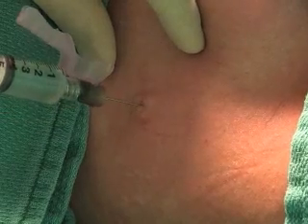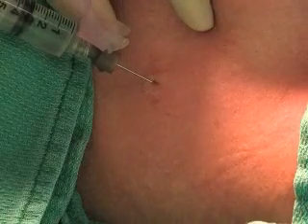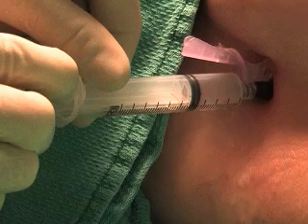Using the larger needle, anesthetize the subcutaneous skin layers through the wheel, aspirating as the needle moves deeper. Anesthetize the periosteum of the rib that lies below the intercostal space where the tube will be inserted.